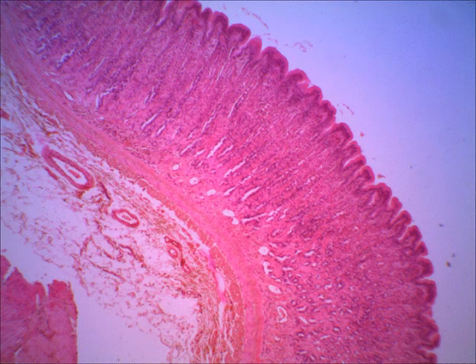Okay, here you see the same organ, but it's just showing it from a different view. I've moved to another part of the wall, and so you're seeing there's your mucosa right there. And so, again, you're going to see the gastric pits. Right, so there would be a gastric pit. There would be a gastric pit. And those lead into the gastric glands.